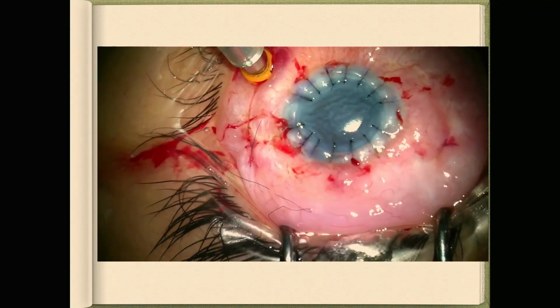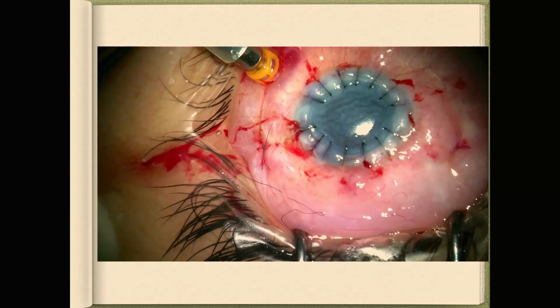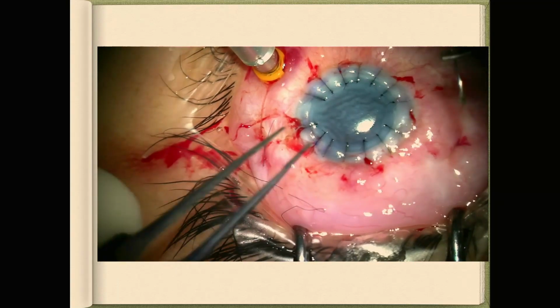Sometimes, I can say that it's better than the normal cornea, removing of this premacular hemorrhage, as we see, and at the end putting the healthy button in these patients. So the take-home message is that the temporary K-Pro is a magic window. It provides you with a magic window that you can end your target at the same session, removal of the diseased button, dealing with the retina problem, and putting at last the healthy button.